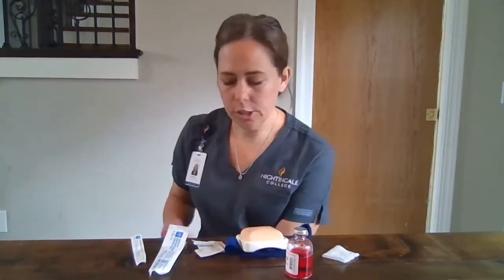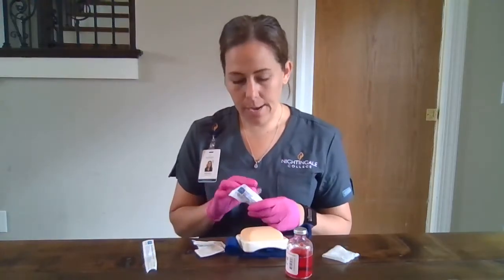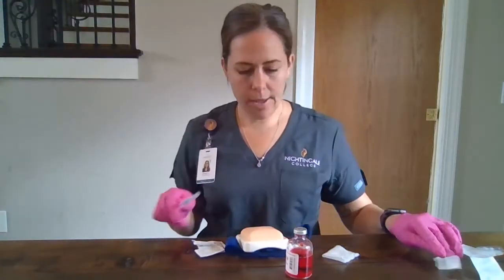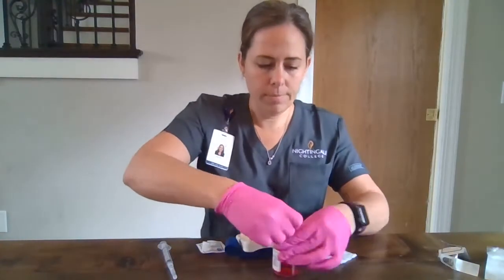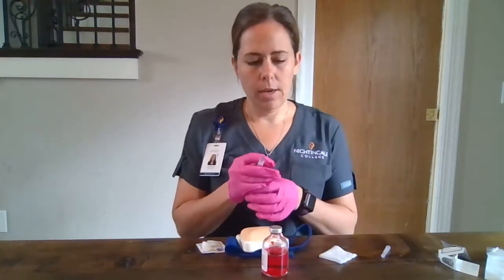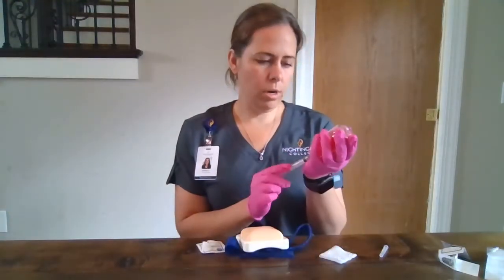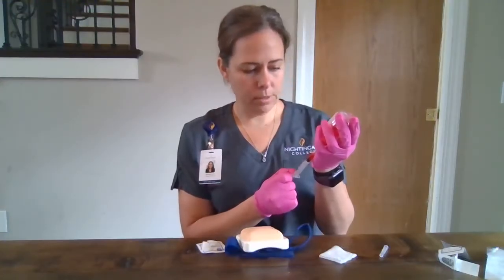All right, and then first we're going to start by verifying we have the correct supplies. So I have a 3 ml syringe and a 22 gauge 1-inch needle. So we will attach those together. We're going to start by wiping the top of our medication vial with an alcohol prep. We'll withdraw 1.5 mLs of air and inject that into our vial, and withdraw our 1.5 milliliters, which is going to be our 6 milligrams.